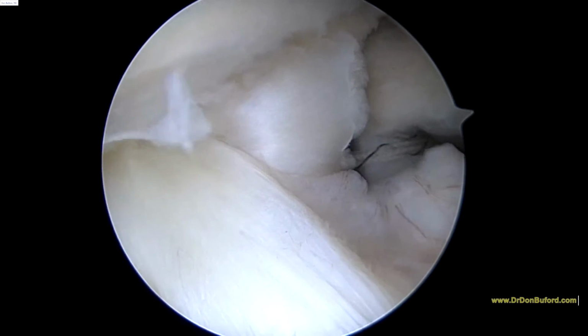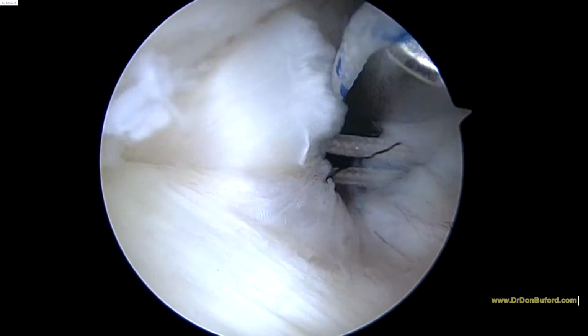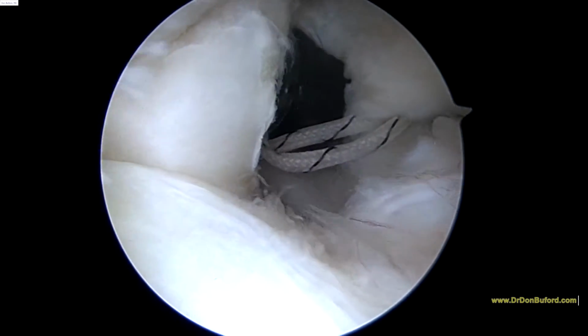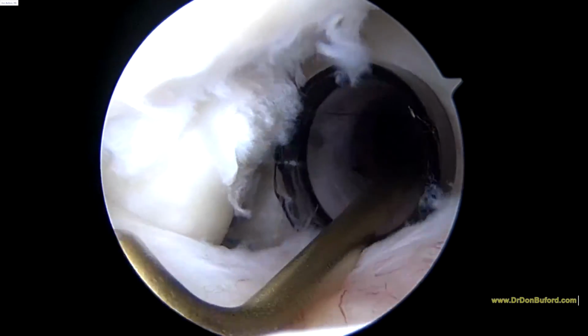Looks like a pretty tight knot there. We'll go ahead and pass point by doing that. And then we'll finish this knot and show you some more in a minute. Okay, so we've tied both stitches, and now that looks pretty good.